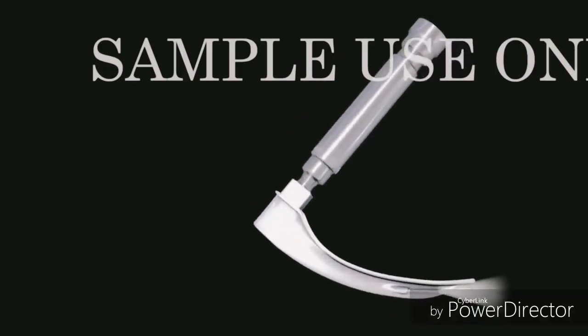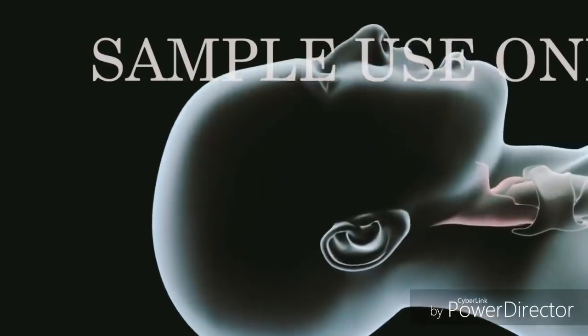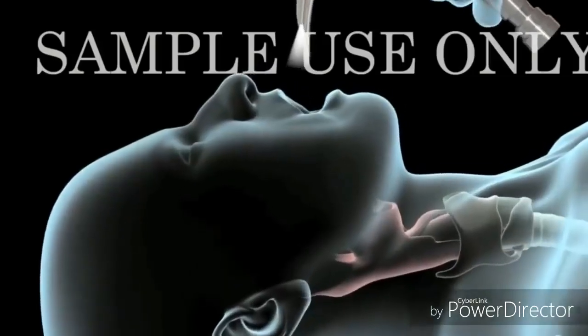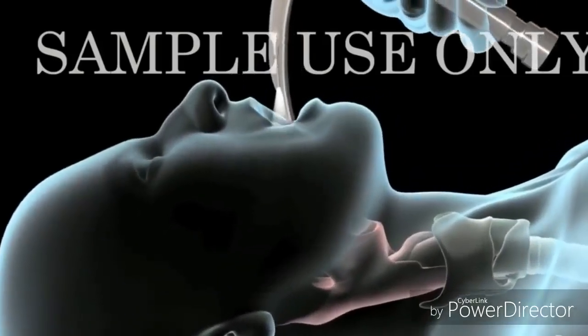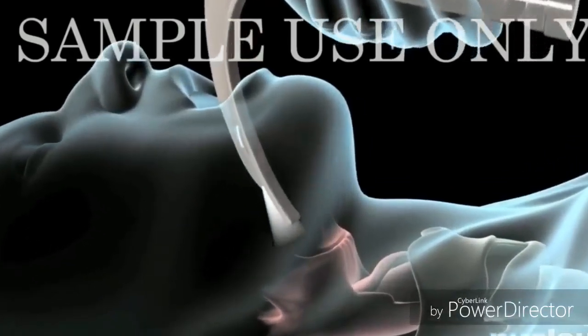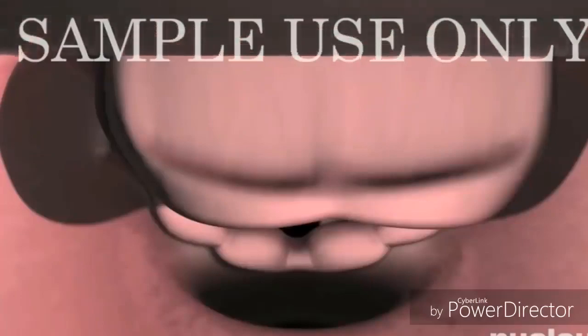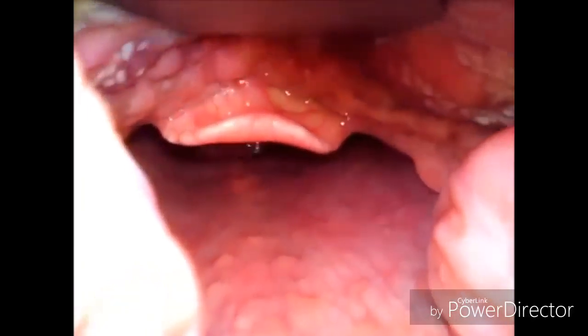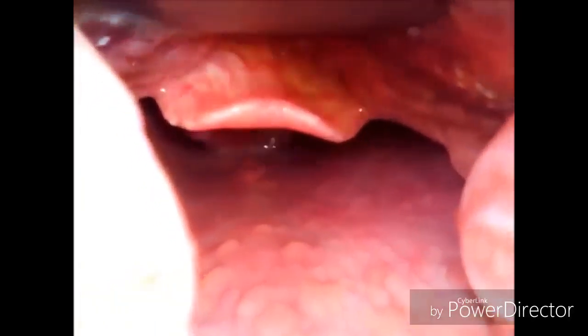Now to perform the process of intubation, slightly extend the neck of the patient. Now we are going to introduce the laryngoscope. Gradually introduce the laryngoscope, and as soon as you introduce it, you can see the uvula, tonsil and the epiglottis, which is covering the trachea. You are supposed to introduce the blade just behind the epiglottis and lift it.